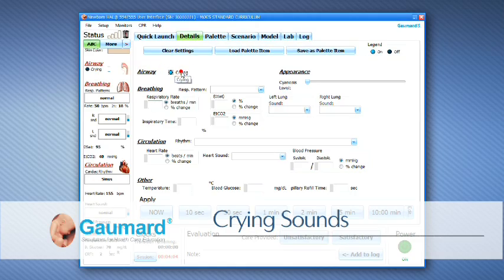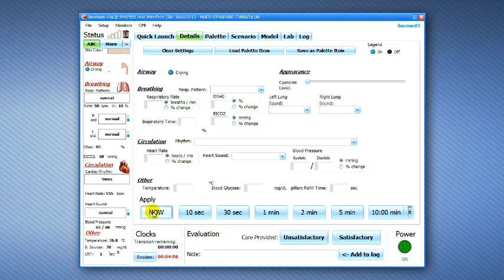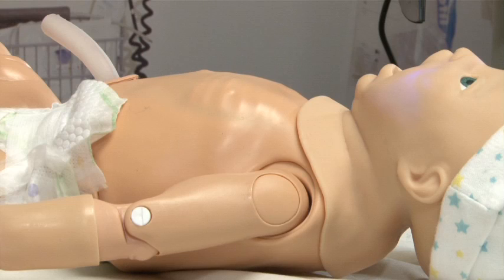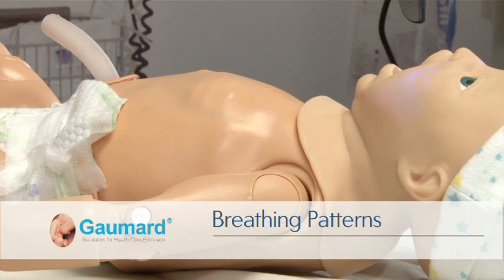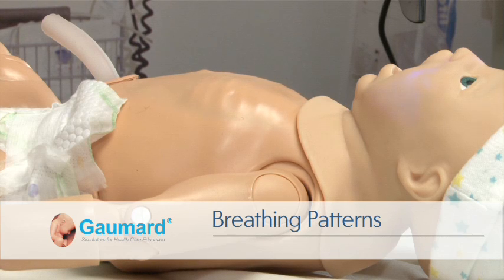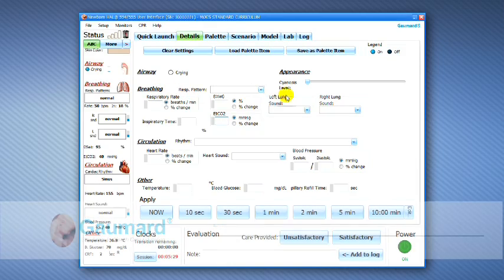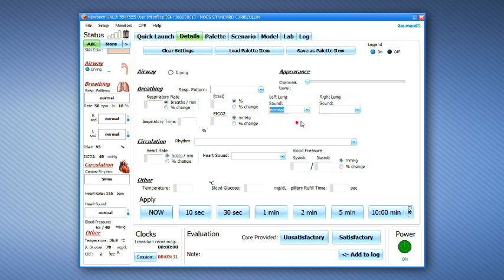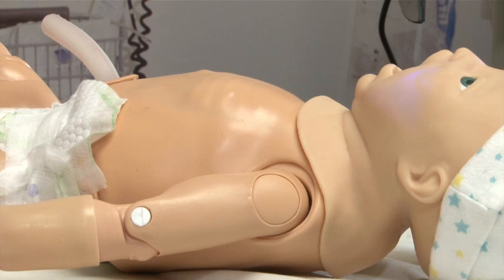Crying sounds can be turned on or off at any time. Instructors can select from independent left and right lung sounds, which are synchronized with any of the available breathing patterns. Instructors can also control the rate and depth of respiration.